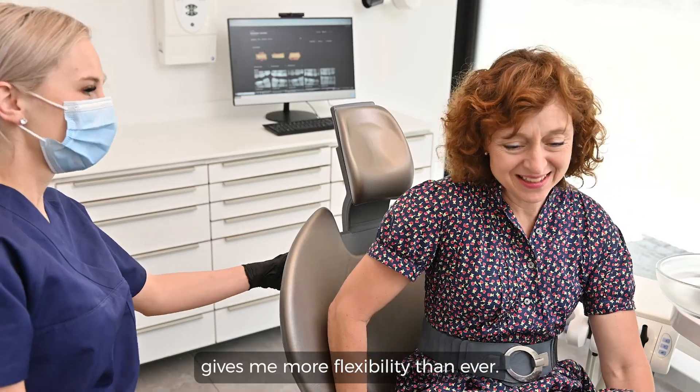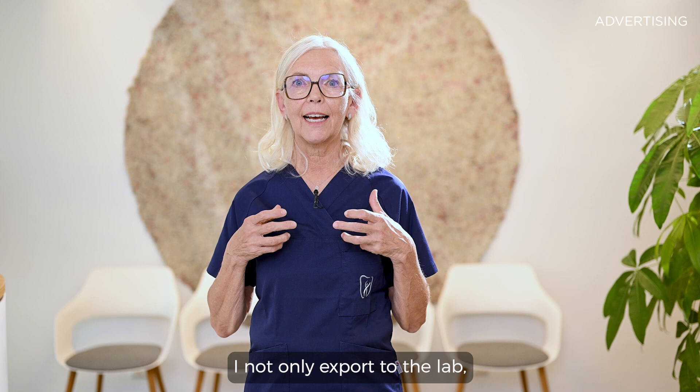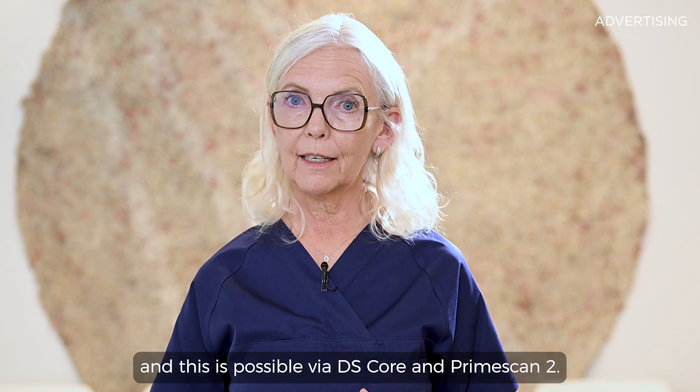PrimeScan2 gives me more flexibility than ever. As a restorative dentist, I not only export to the lab — I also prefer to make in-house manufacturing, and this is possible via DS-Core and PrimeScan2.